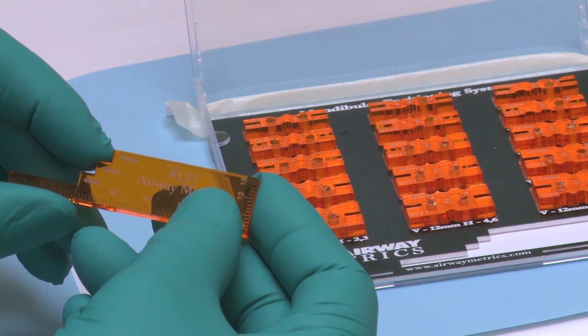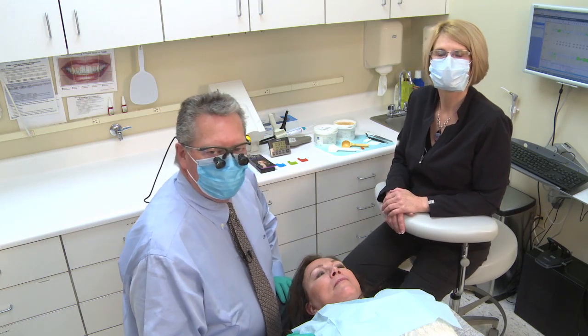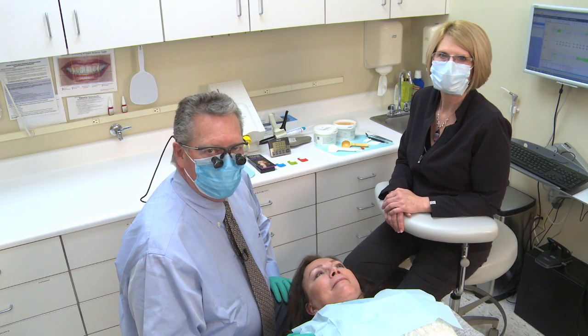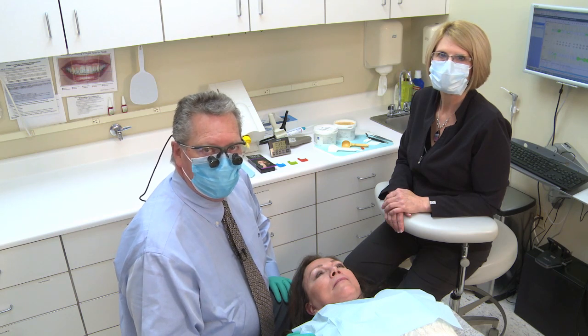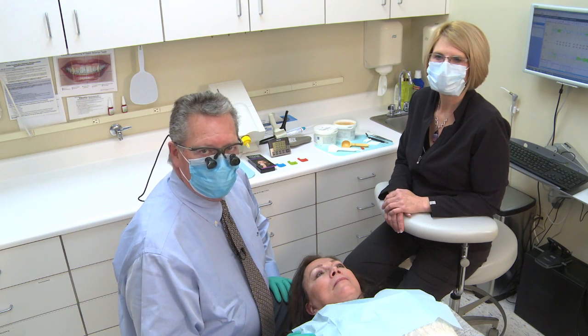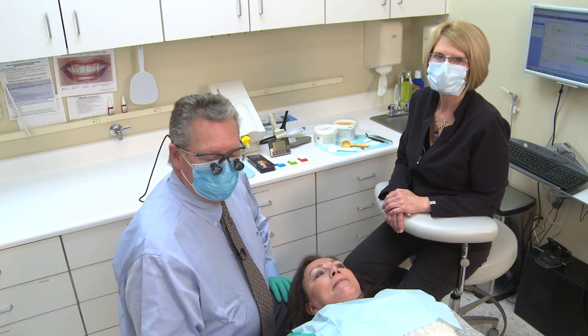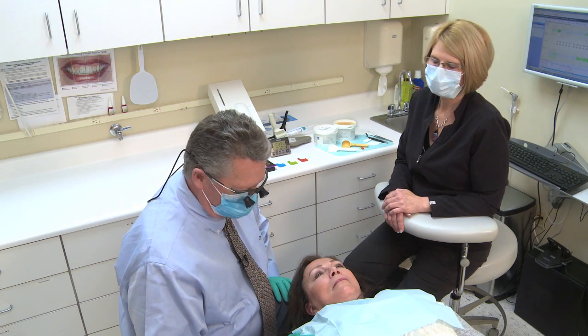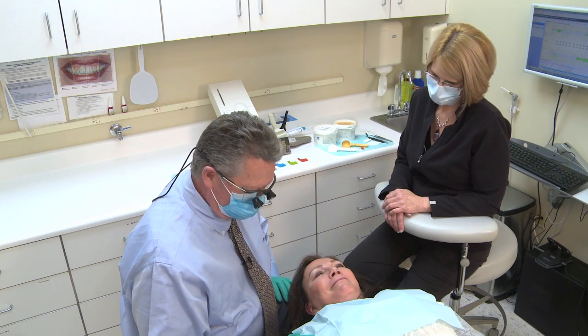height. So we're with our patient, Kim, and we're now going to start to focus on where we want the appliance set. So we have to determine some sort of vertical and horizontal component. And for determining the bite, we're going to be using the Airway Metrics system. And this is where it becomes very interactive with our patient and Kim. This is where it becomes a lot of fun.